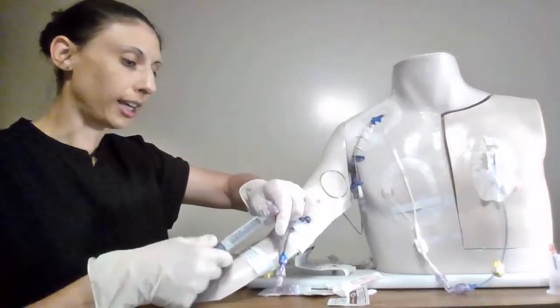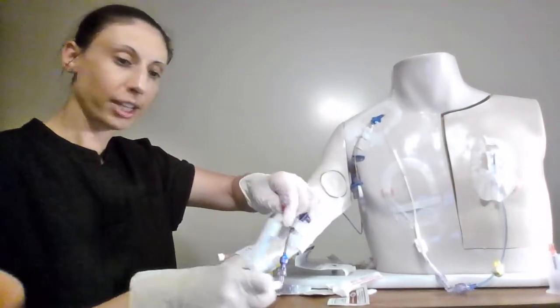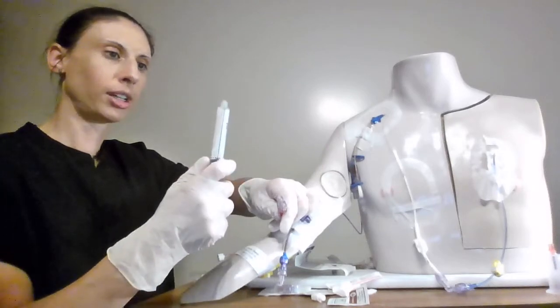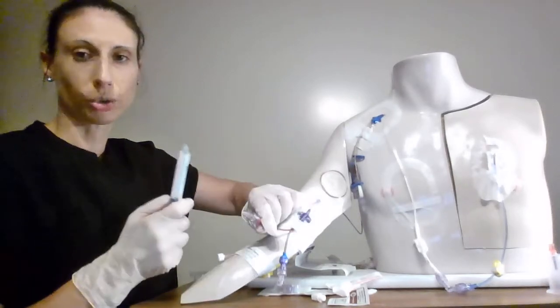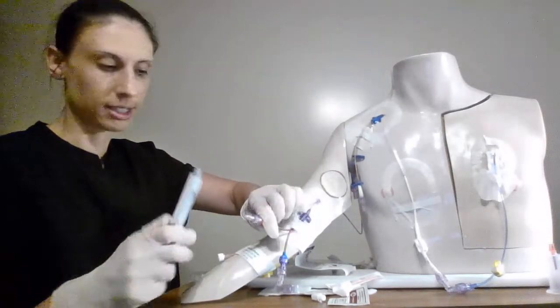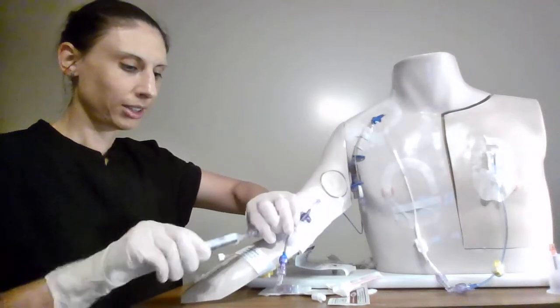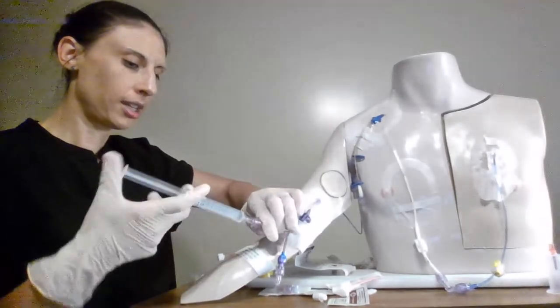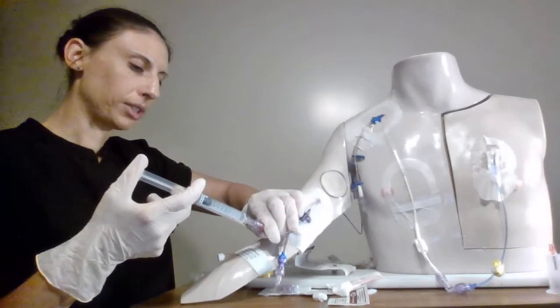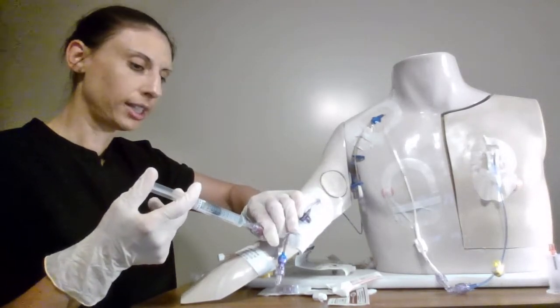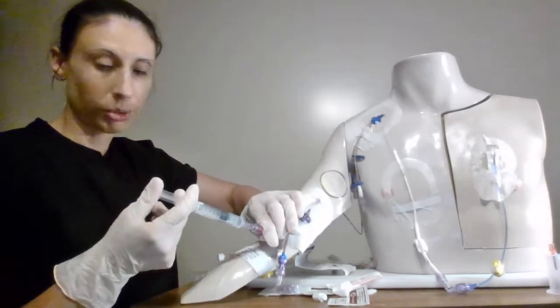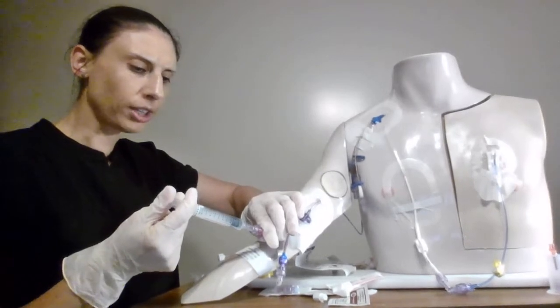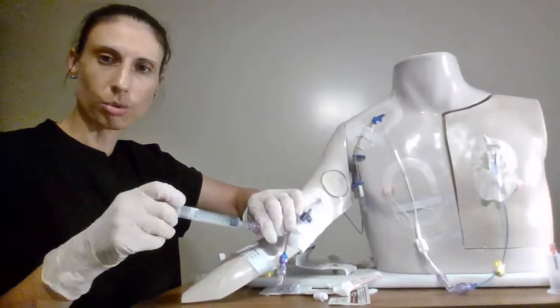Because there's no heparin inside this line I am safe to come and just attach a flush because all I'm doing is flushing normal saline that was previously instilled or locked. I'm just going to flush that through and that flush is really nice. So 10 cc is an adequate flush however if you're finding that your line is sluggish you can always flush with a little bit more.